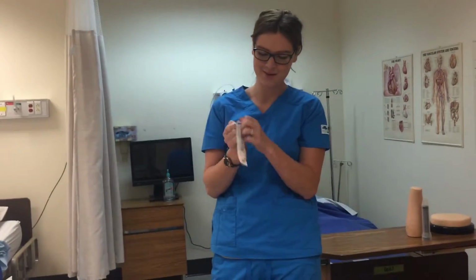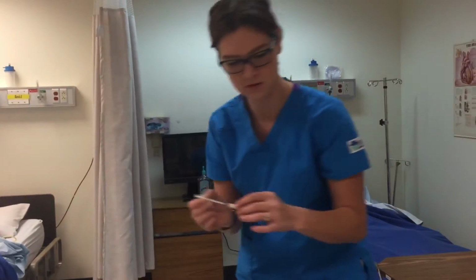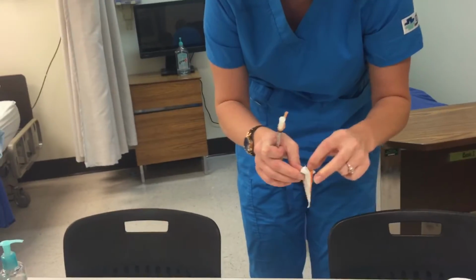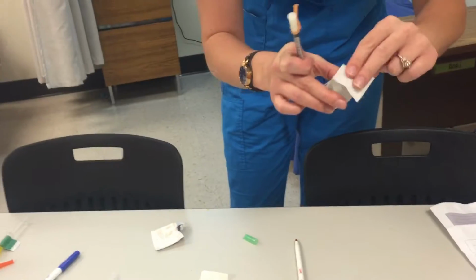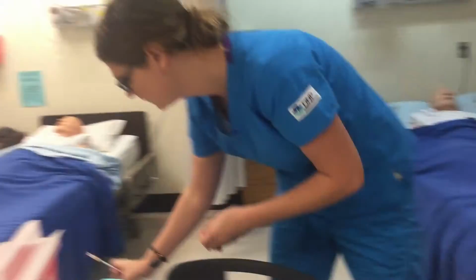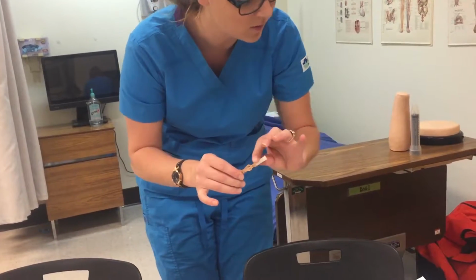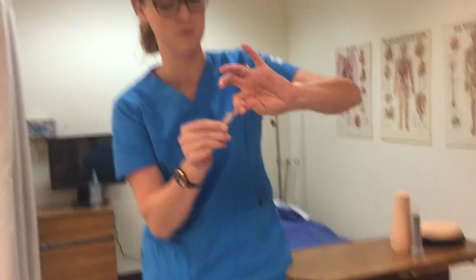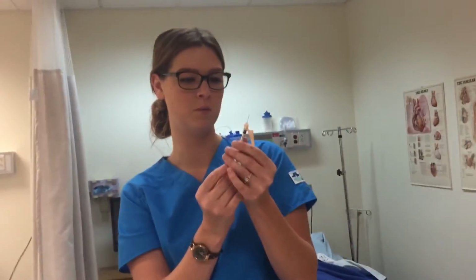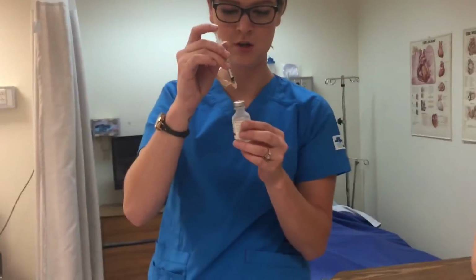Okay, so now I'm gonna open up my TB, open it like this, just handling the back part. I'm going to take my alcohol swab, clean the top of the vial. Okay, I would let that dry completely. Move the safety out of the way. So I'm going to use 0.1 mils. So open like this. I'd pull the syringe back to 0.1 mils. Okay. I'm going to inject that much air into my bottle.